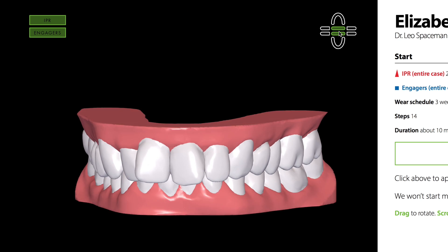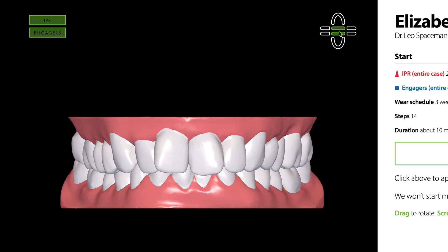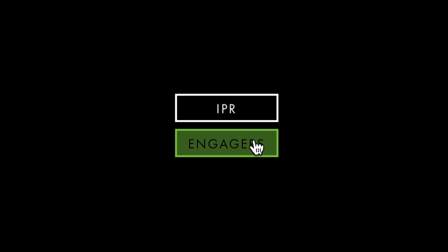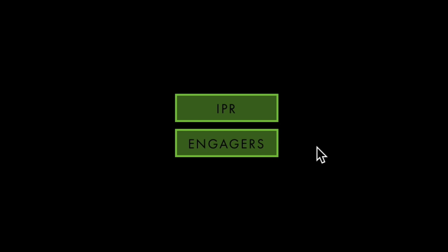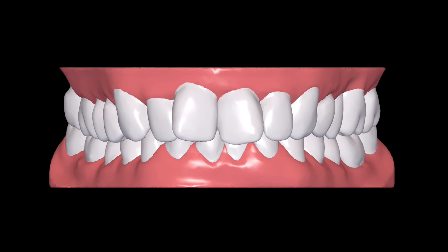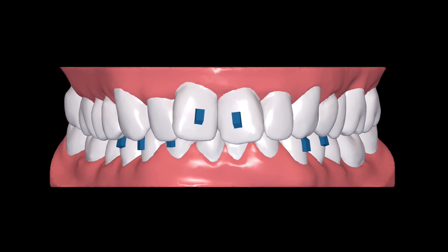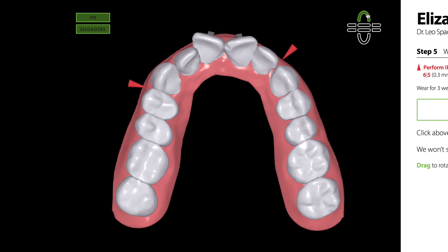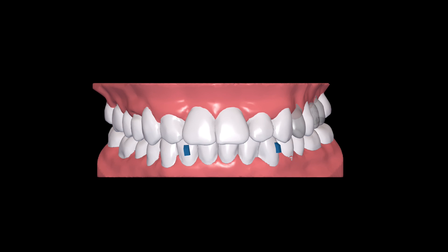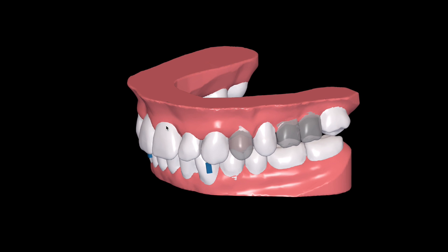If your case includes IPR or engagers, you can show or hide them by clicking these controls. Engagers are shown in blue when they're first placed, and in grey on subsequent steps. IPR is represented by red cones, and pontics are represented as translucent teeth.